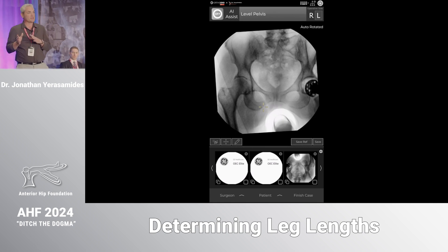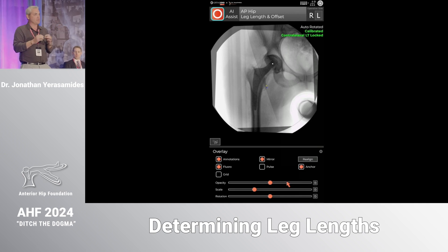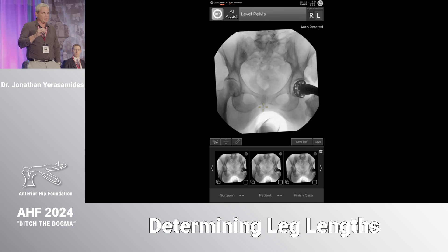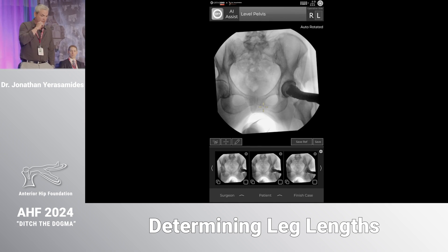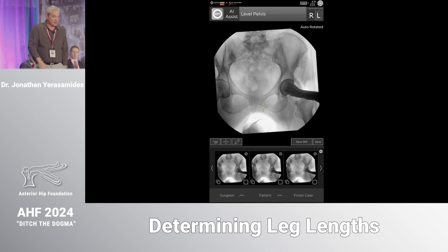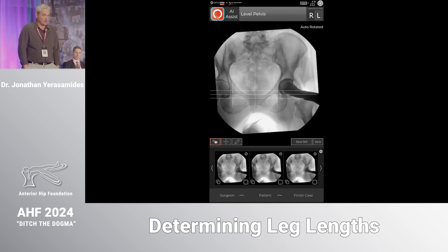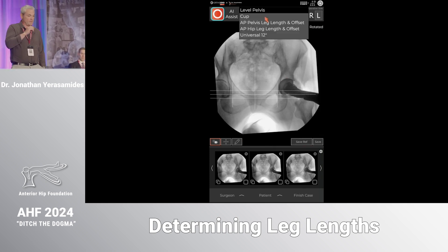These landmarks need to be symmetric to verify the pelvis is level. Some guys want to use the obturator foramen and match up shapes, but I can't look at two geometric shapes and know they're exactly alike. John Cooper mentioned doing a single reamer, which I do too. Once I rotate the bed towards me we're level — cup bottom at the bottom of the teardrop, all the way down to the medial wall, unless someone has super excessive offset.